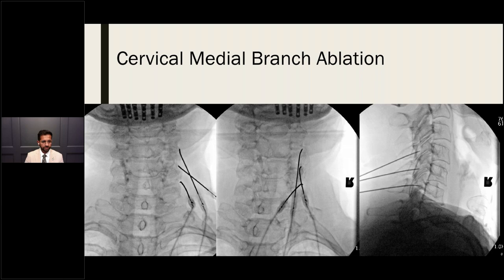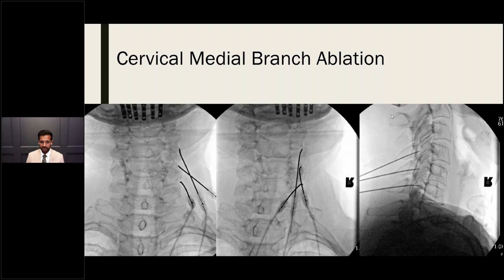Cervical medial branch radiofrequency ablation is performed after successful diagnostic blocks for facet-mediated pain. The AP view shows the needle advancing toward the articular pillar scalloping to identify the correct level. A 15-degree ipsilateral oblique shows alignment of the articular pillar. The lateral image, though not perfect, was used with sensory and motor testing — adequate motor testing confirmed lesioning could proceed safely.